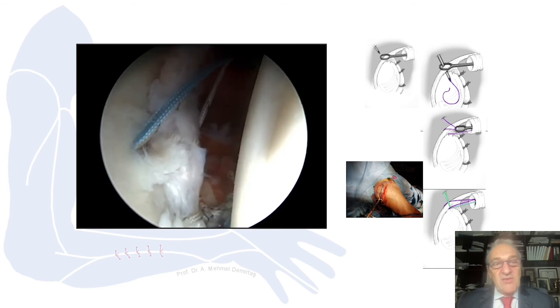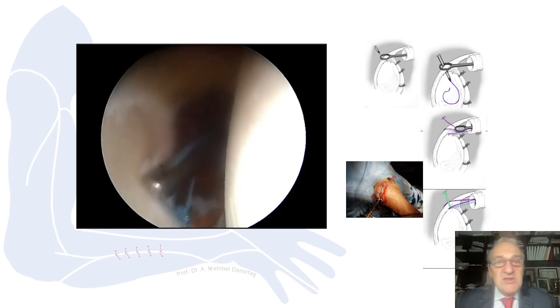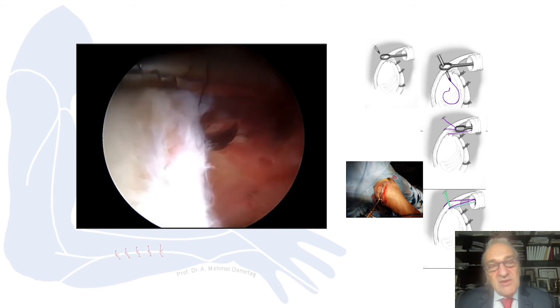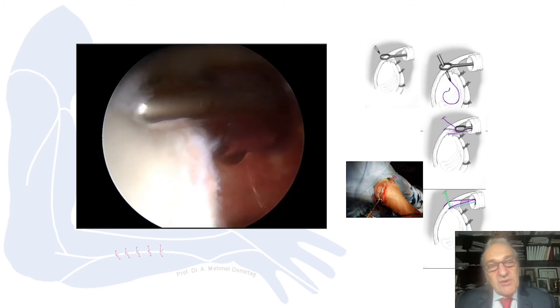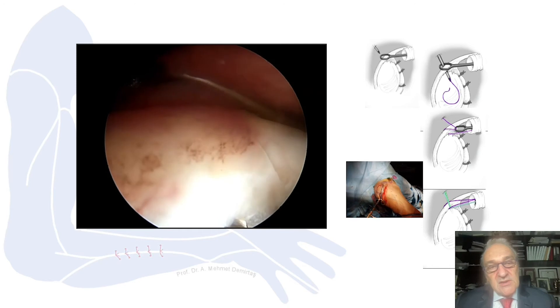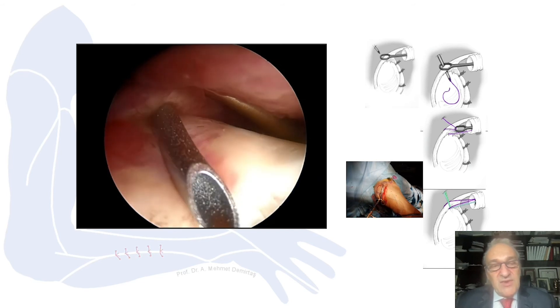From the same portal, we place the third anchor. Now you can see the SLAP lesion. It is debatable whether to repair the SLAP lesion first or not — some authors want to repair the SLAP first and then the Bankart, arguing that the biceps also contributes to stability once the SLAP is repaired.